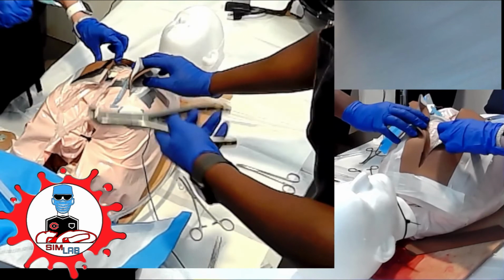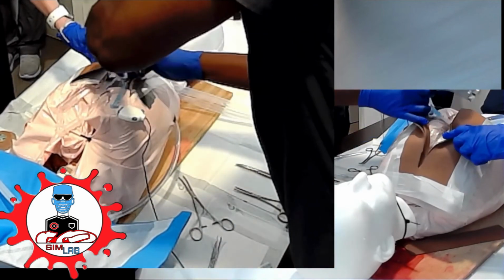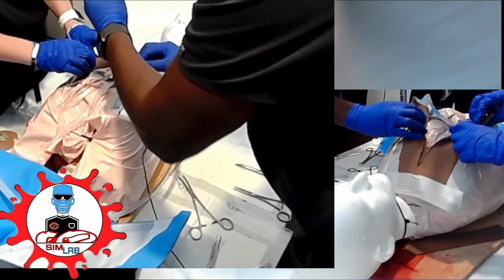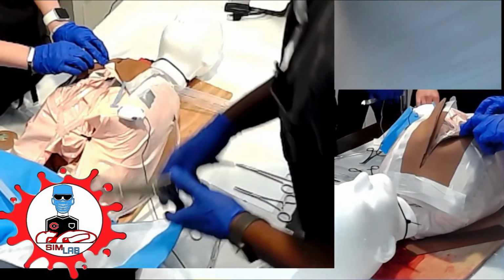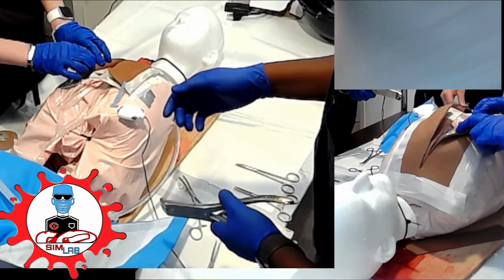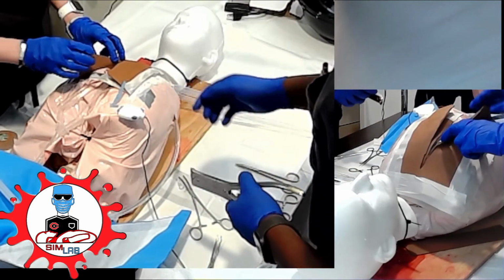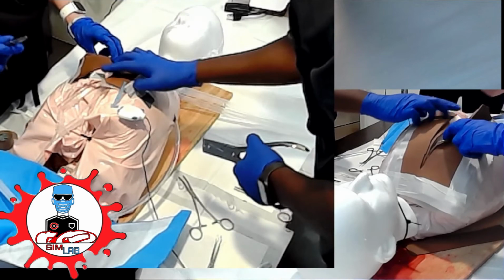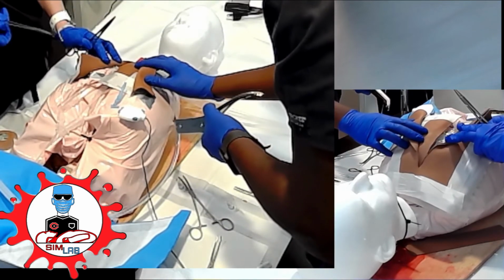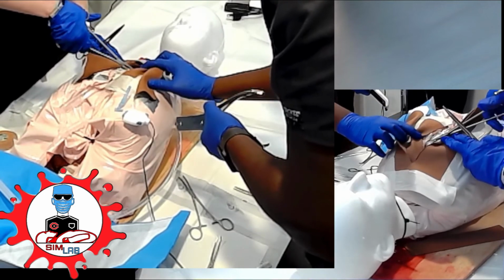And then use the wire cutters. Yep. Just pull them up to you. So you see how they're pointed down flat? So we have somebody else with the hemostat, needle driver. If you want to pull them up, then let him snip, and then you're going to pull them away. So point towards the ceiling and then cut them.